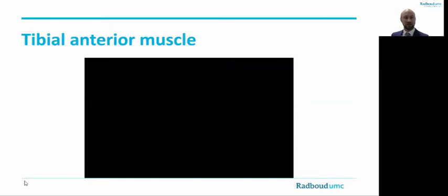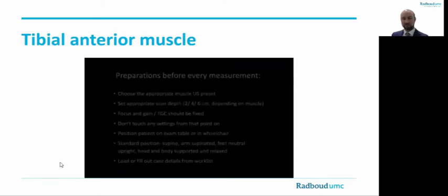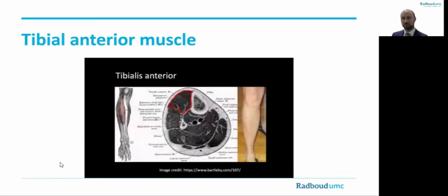Let's continue to the tibialis anterior muscle. This is the protocol for scanning the tibialis anterior muscle. The subject is in a supine position with the limbs relaxed. To standardize the measurement, we scan the muscle at the site of its maximum bulk. For the tibialis anterior muscle, this is at one-third from the lower edge of the patella to the lateral malleolus. This position is marked on the skin.